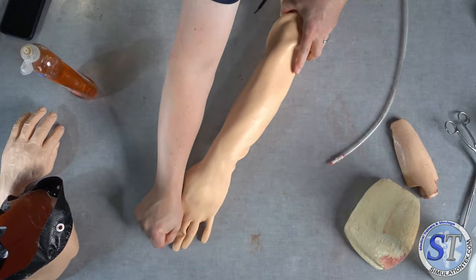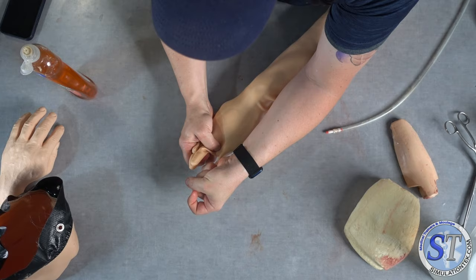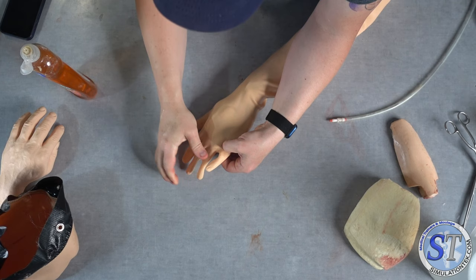Or you might think you got lucky, and you didn't, like I just did. Because my finger's all in there folded out, so I've got to slide it off a little bit. Usually the thumb's the last thing. I got fooled.